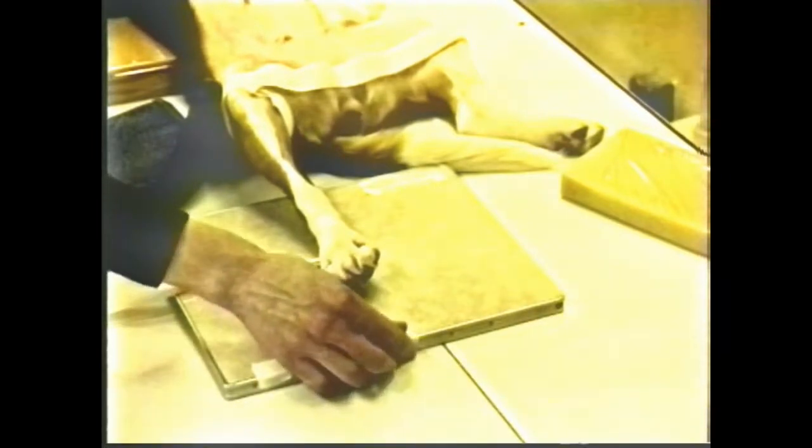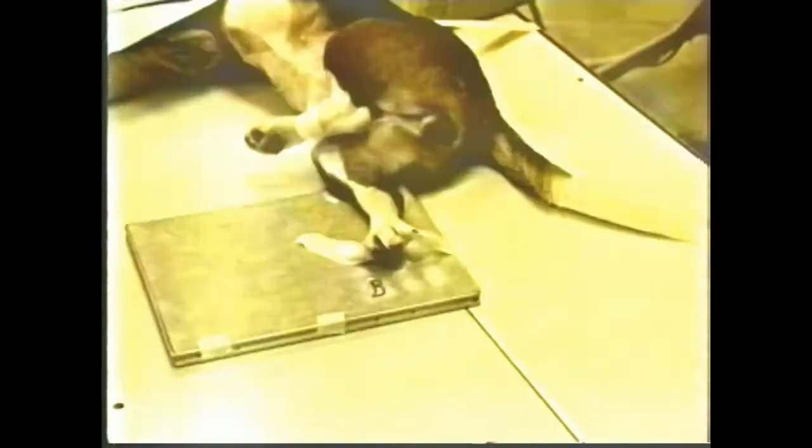We have now moved to the second exposure. You will notice the tape that has been placed on the edge of the cassette indicating the first exposure. The cotton is still between the toes and the leg is in a relaxed position for this exposure. Following this exposure, the cassette is marked with a second piece of tape, and then we move to the third oblique. This oblique is made with tape holding the digits apart to separate the toes.